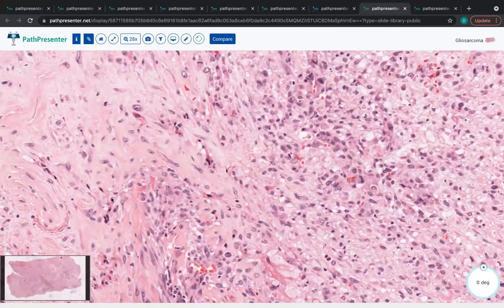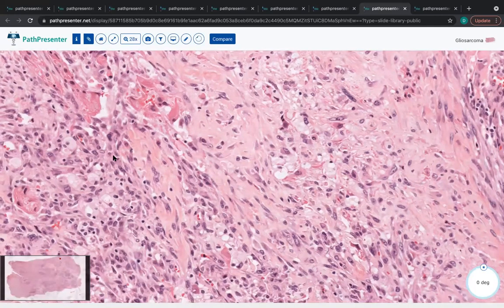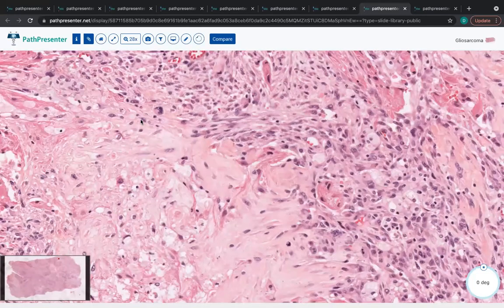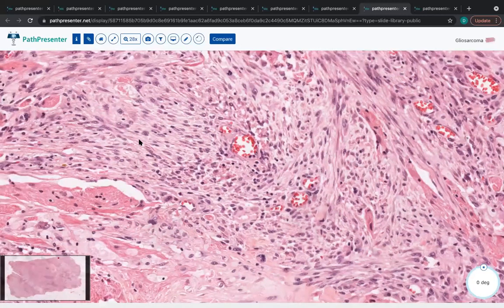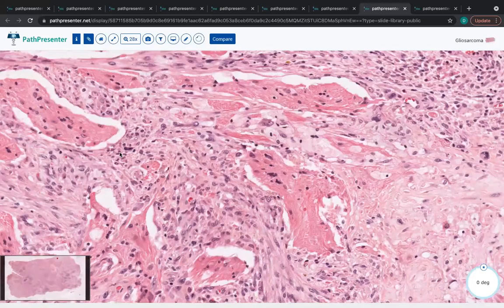Okay. And the prognosis, for grading, I'm sorry, go ahead. Oh, sorry. The prognosis depends on the sarcomatous component or the glial? No prognostic significance to this whatsoever. It's just an interesting histologic subtype of glioblastoma. They're grade 4 tumors. I've never seen this morphology in a lower grade tumor.